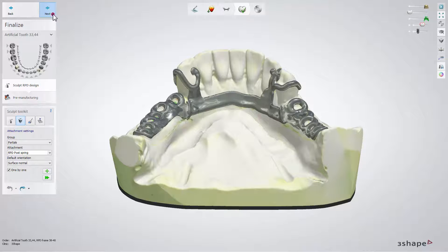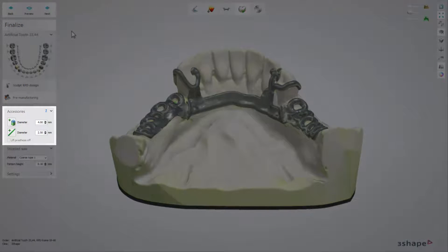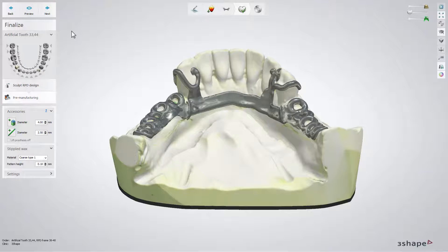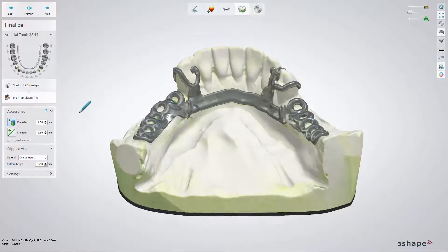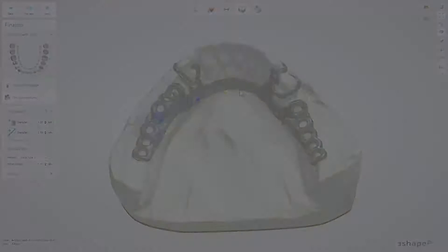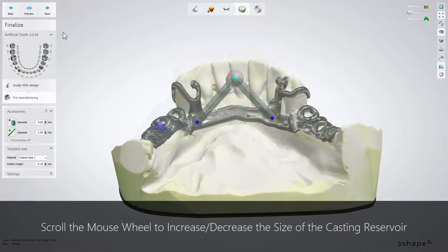Click Next to proceed to the pre-manufacturing sub-step. At this sub-step you can add tissue stops and support bars to your denture. Click the Add Tissue Stop button, specify the desired diameter of stops, and left-click on the model to place it. Then select the desired diameter of the support bar and click the Add Support Bar button. Create it by placing two control points on the model and then left-click — it will be automatically placed.